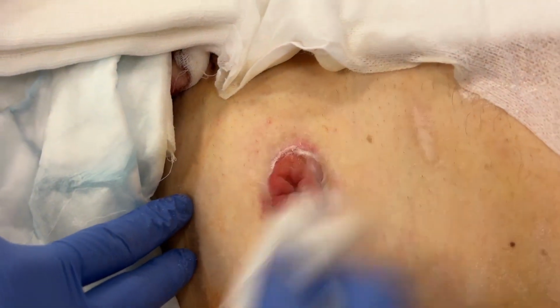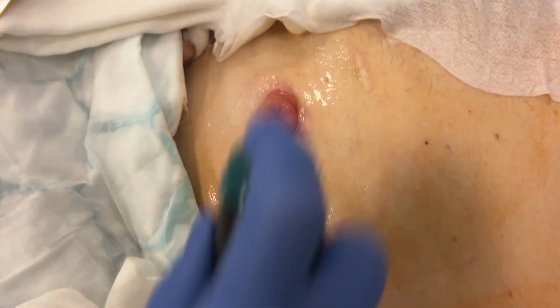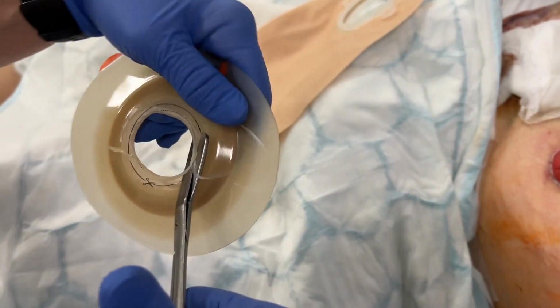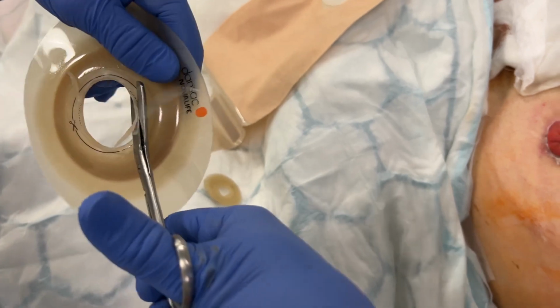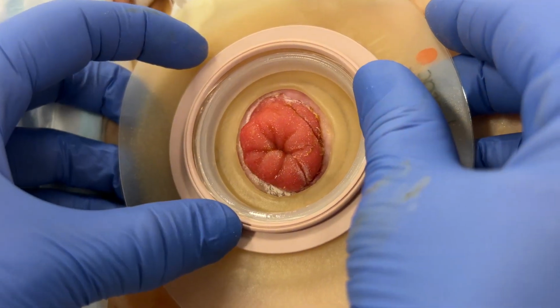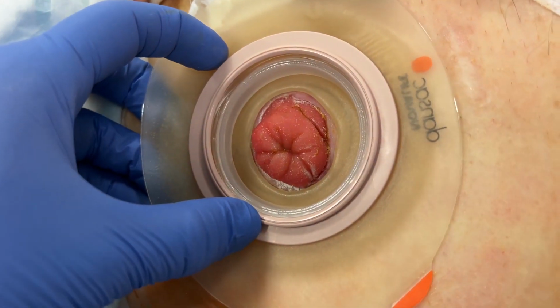After treating the peristomal skin, we measure and cut a convex base plate, testing the opening size before application. For this type of appliance, the opening should be cut 3 to 4 mm larger to prevent damage to the stoma. Solid stool passing through the colostomy increases the volume of the intestine, which could lead to stoma constriction.